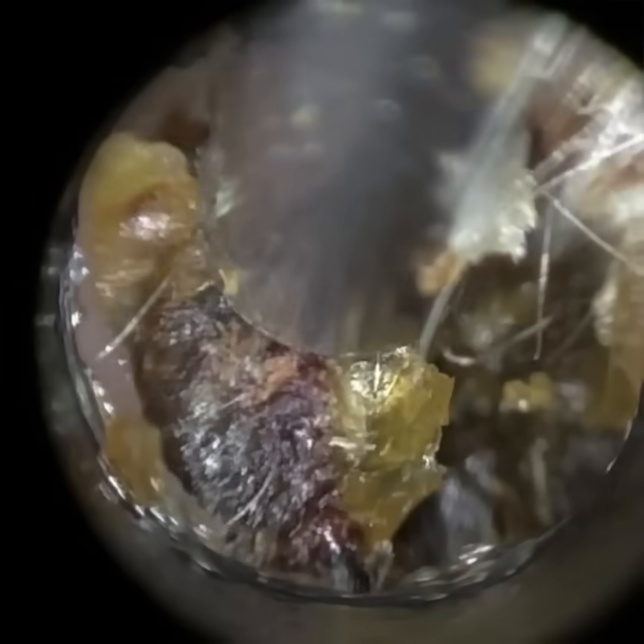So this is a large piece that's broken up. So it's now just a matter of trying to bring this out of the ear. But the surface of this keratin is quite solid, and so it's difficult to get a suction grip. The sucker is gliding off it because it's so smooth and flat and hardened.